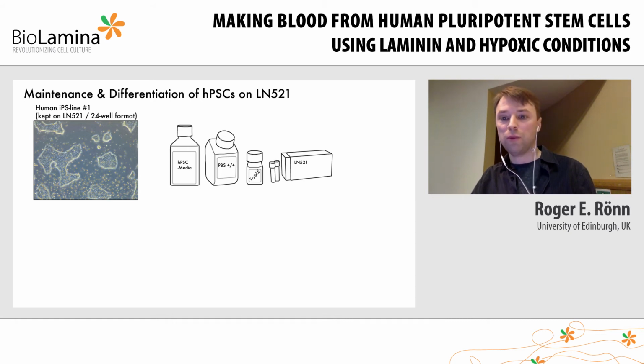And here I will give a brief overview of how this new routine compared to an older method for cultivating our HPSCs. All that is necessary with the new method is a standard plastic culture plate, some PBS, TrypLE Express, a commercially available HPSC media, some laminin 521, 15 minutes of my time every 4 to 5 days to do passaging, and of course the 2 to 3 minutes every day needed to perform daily media changes.